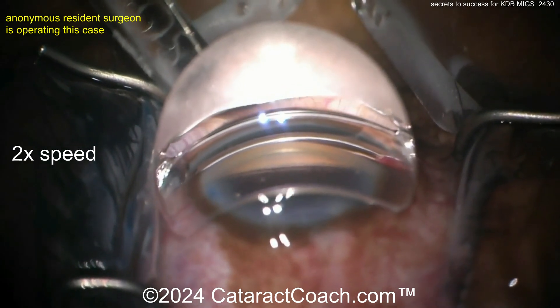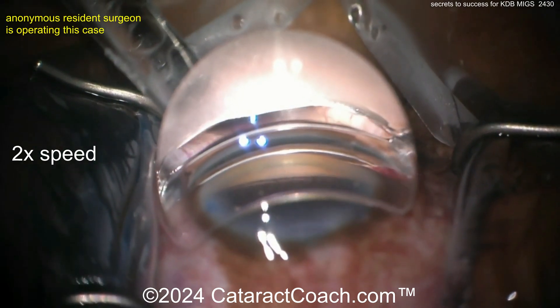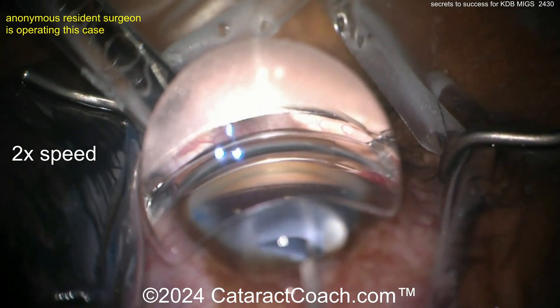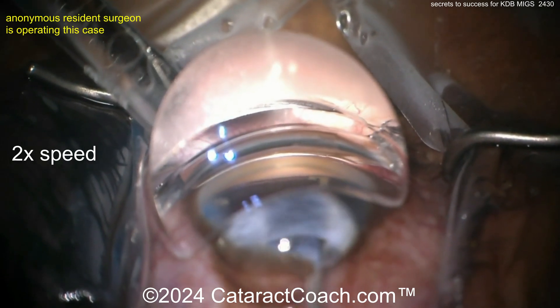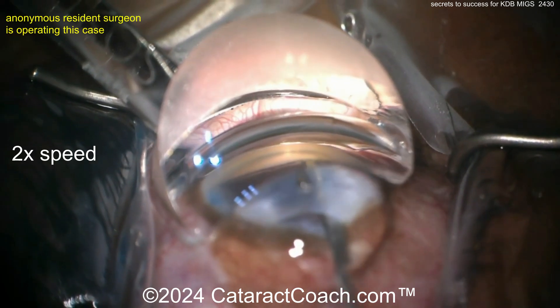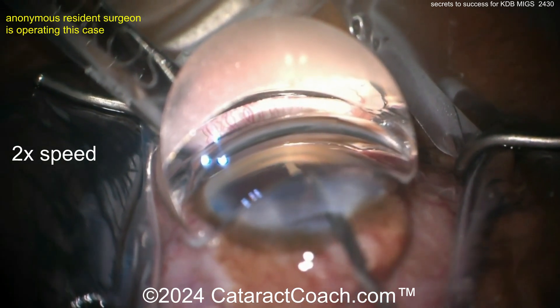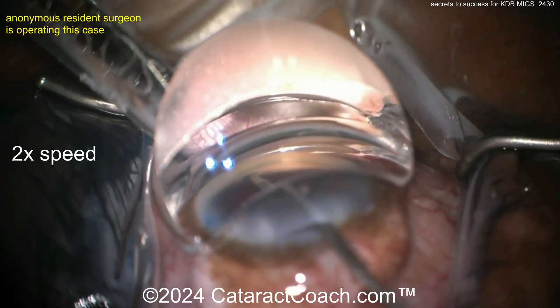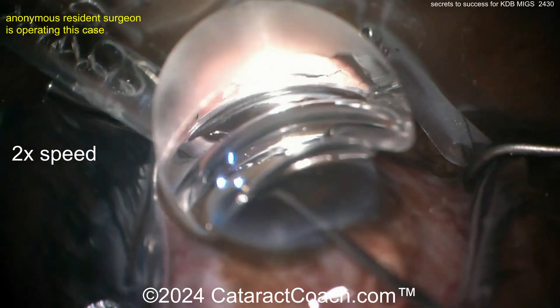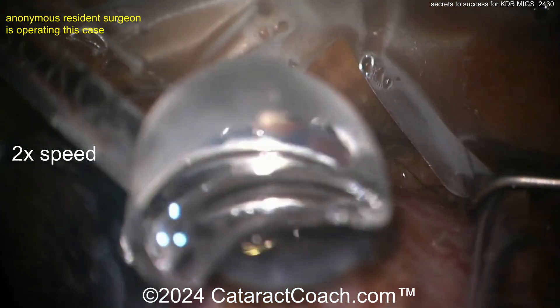Now let's get that KDB going inside the eye. This blade is allowing you to strip away a nice section to open up the canal. You can see the blade going in — you want to have a nice arc motion and it should glide along very easily. Keep going: pivot, pivot, pivot, pivot. Remember it is a complete pivot.